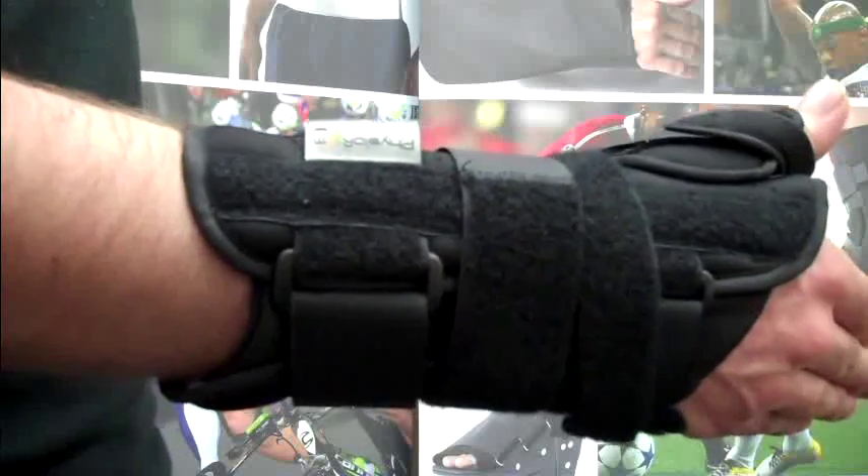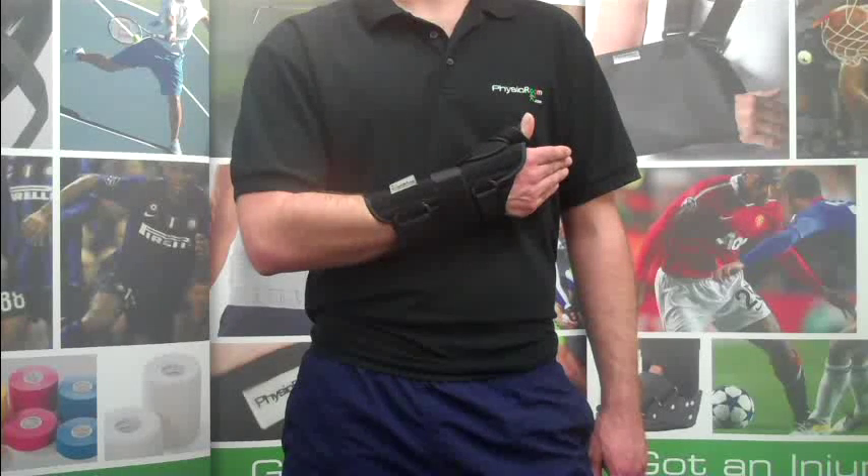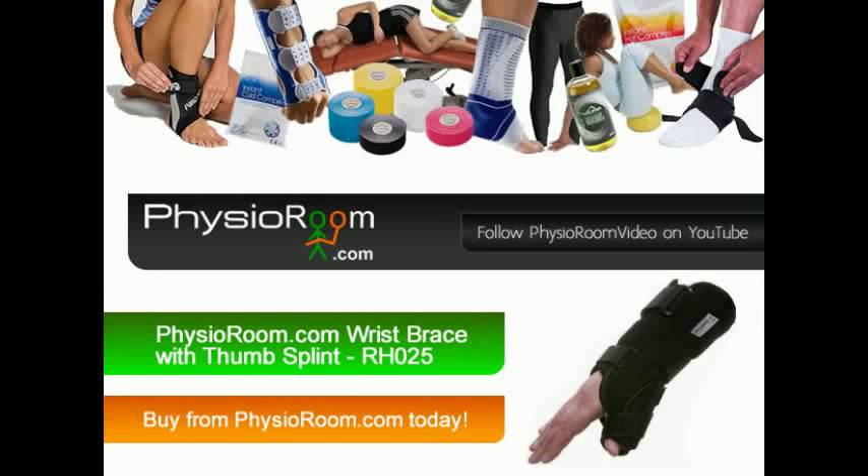The PhysioRoom.com Wrist Brace with Thumb Splint is available in all sizes and can be purchased for the left or right hand. So order your PhysioRoom.com Wrist Brace with Thumb Splint today.